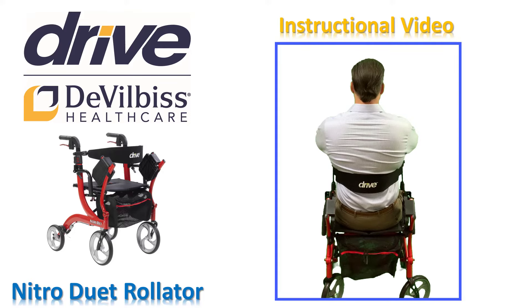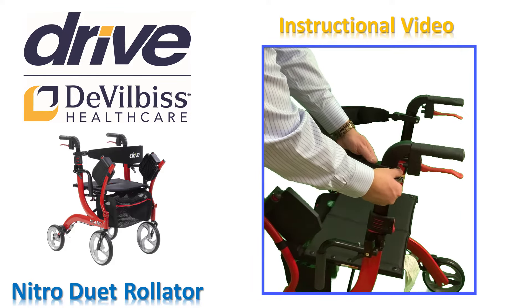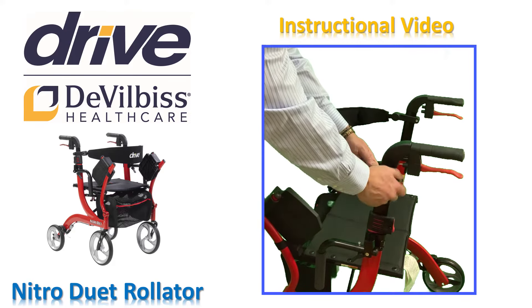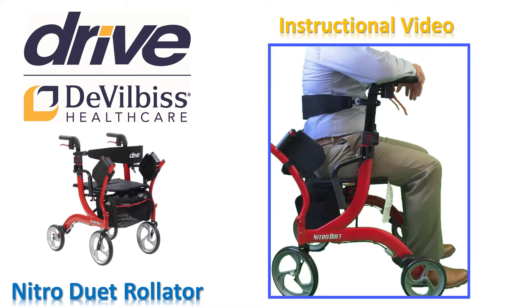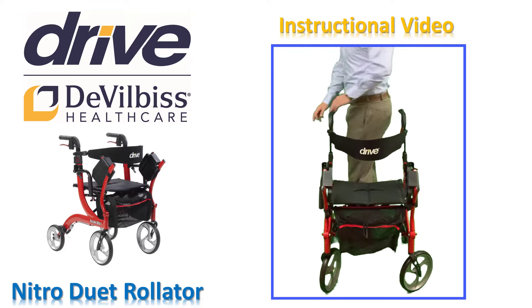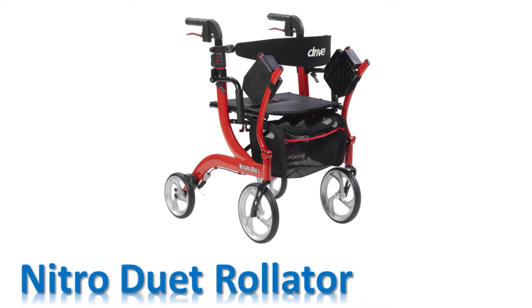The backstrap should support you in the middle of your back, about halfway between your waist and shoulder blades. Turn the knob counterclockwise to loosen, slide the backrest to the desired height, then turn the knob clockwise to tighten. Always sit with your back to the backstrap. When sitting, never lean back — sit with your back straight for your safety. When you are ready to stand, put your hands on the hand grips and use them to assist you as you stand up. Your Nitro Duet Rollator is now properly fitted to your needs and will be safe and comfortable for many years to come.